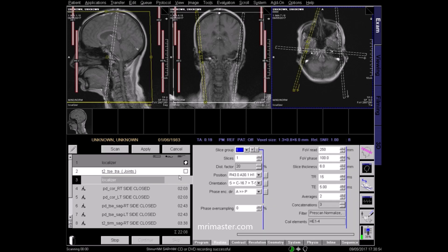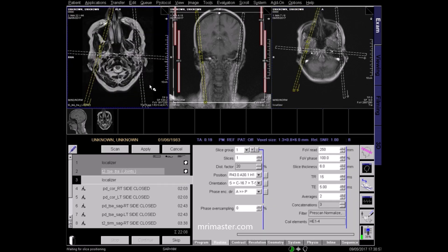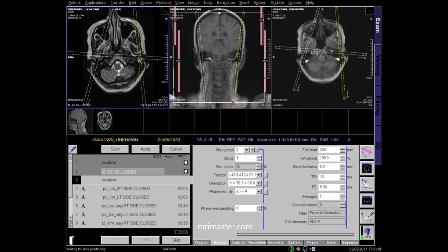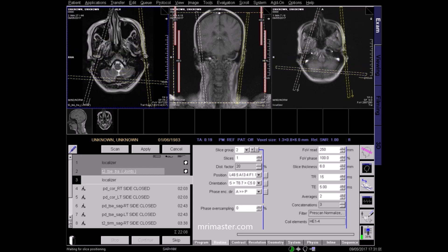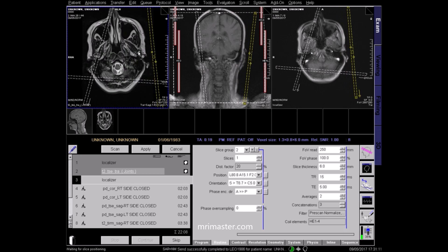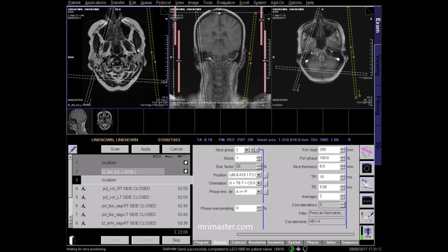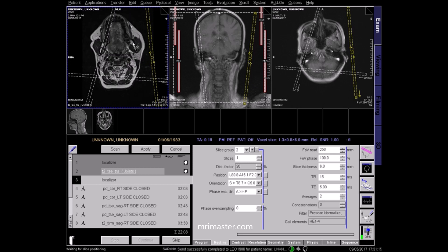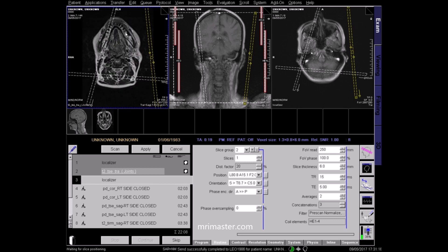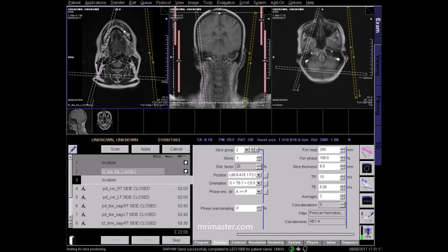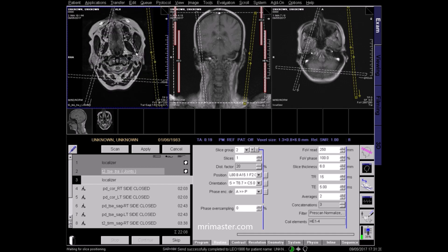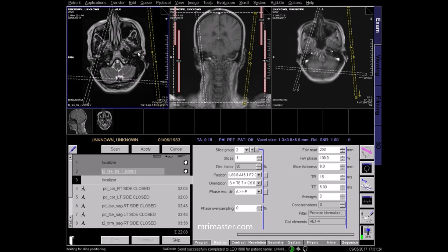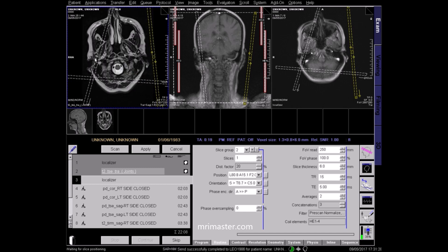This next sequence is a localiser of the TMJs themselves. We should plan this on the acquired T2 axial sequence. Scrolling through, locate the mandibular condyles. This is the left condyle tracing down into the ramus and into the body of the mandible where the lower teeth are situated. And this is the right.